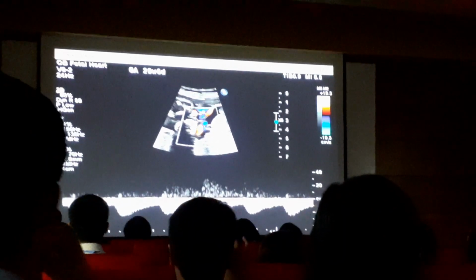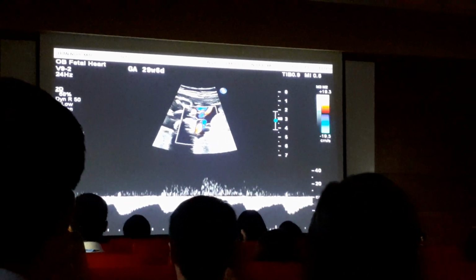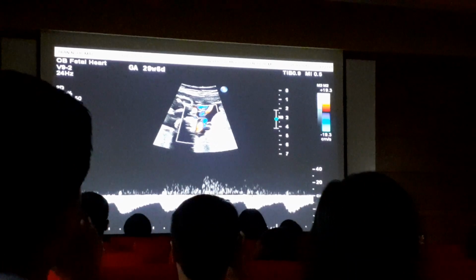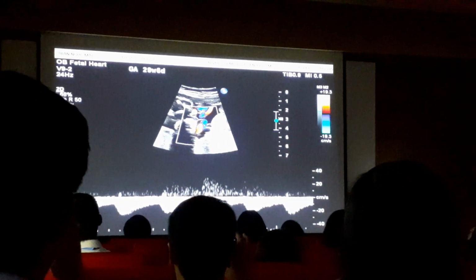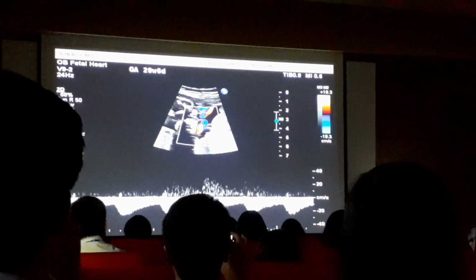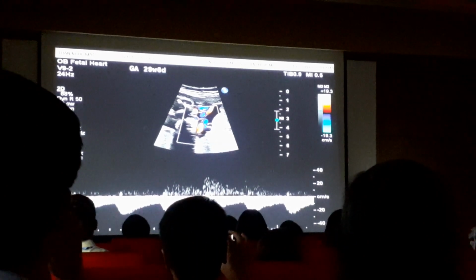And comparing the umbilical artery pulsatility to the middle cerebral artery pulsatility. This looks normal, no evidence of brain sparing. High resistance brain, low resistance cord. Như vậy chúng ta thấy là cái so với lại cái của Doppler của động mạch não giữa thì chúng ta thấy cái này cũng không có gì bất thường.